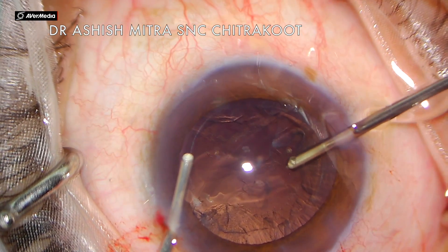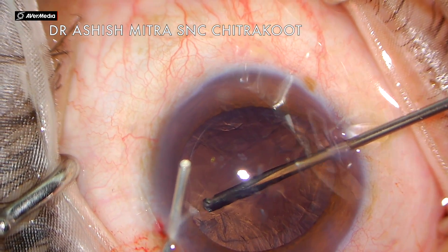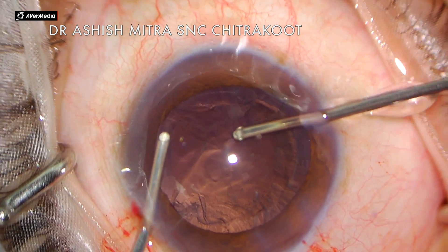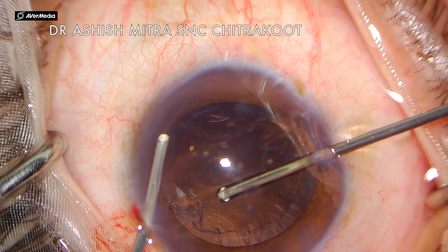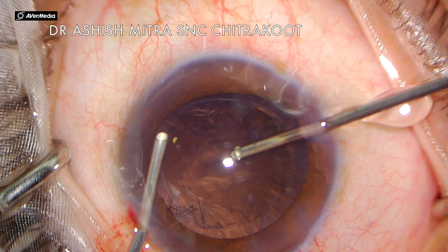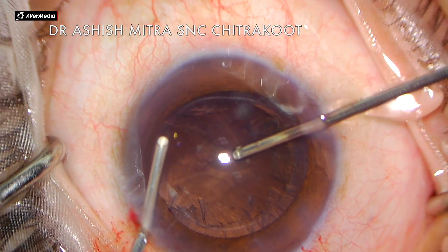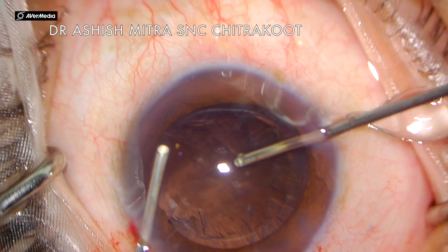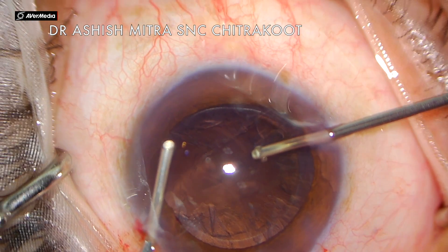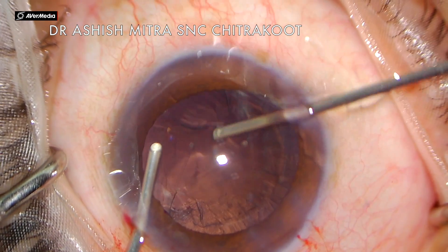In cut IA mode, the cutter is working and there is not much aspiration, so initially I am cutting the vitreous. When I then switch to IA cut mode, I am aspirating the cortex without pulling much vitreous. You have to take time — cut vitreous before jumping to aspirate that cortex, because if vitreous is present during aspiration you would be pulling cortex and causing traction to the retina.